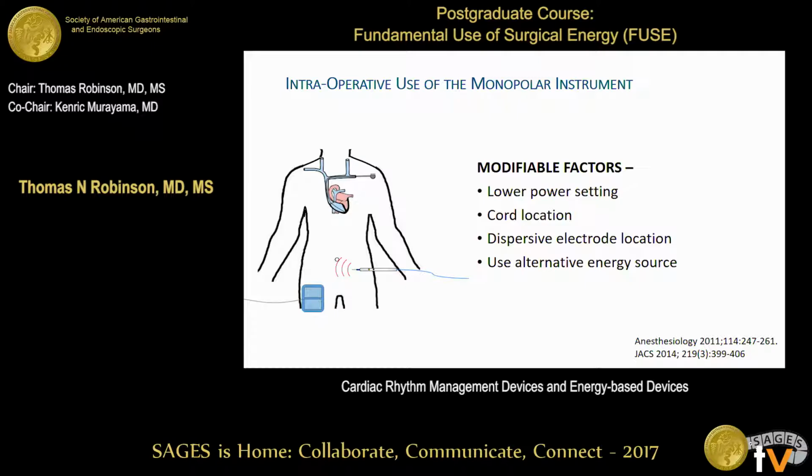The reason for that, and I think this may be historic, is that when you put a magnet on, when you remove it, your generator doesn't always go back to the initial settings that it was on. And so in the guideline statements, if you ever use a magnet or if you ever do an operation on somebody with a cardiac implantable electronic device, you're supposed to reprogram it at the end of the case. So when you put a magnet on it, for a pacemaker, it goes into asynchronous mode, and that generator does not always go back to those initial settings. So that's what Mark would say.